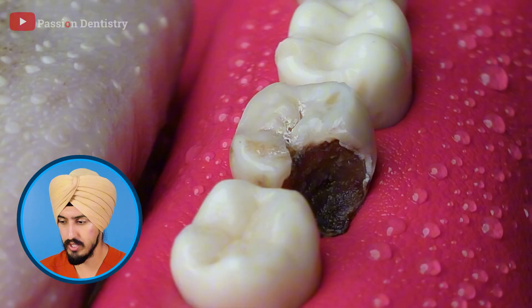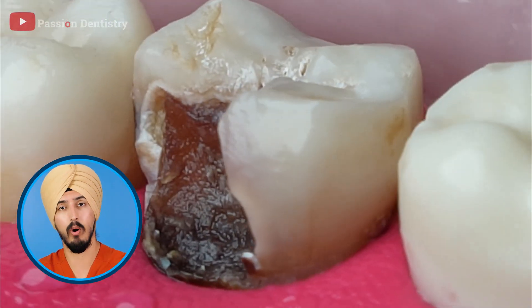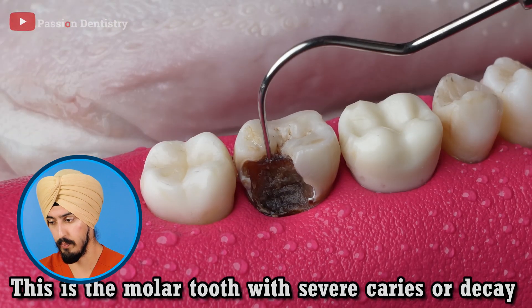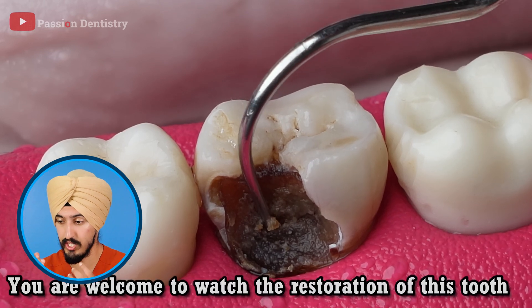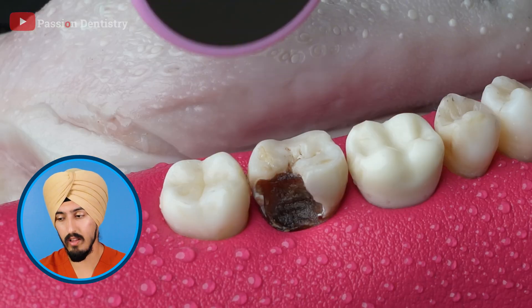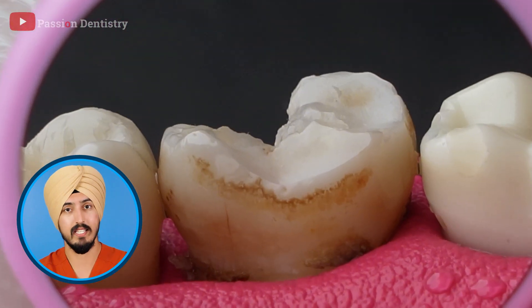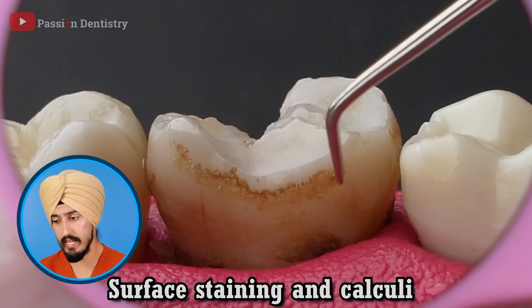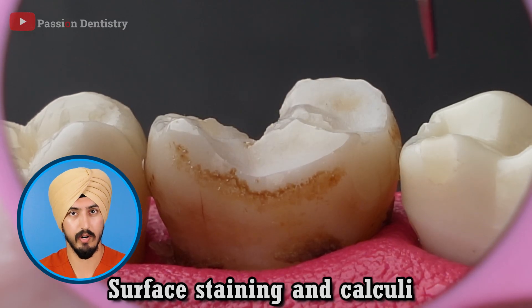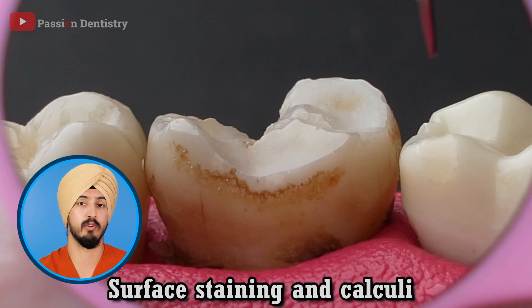So it's kind of just showing the tooth. That's a big cavity that basically looks like it's into the nerve and it's taking up a whole bunch of that tooth structure. He's checking it and that decay — the cavity part — is actually really soft. So when you take that explorer and feel all that stuff it's going to feel really soft. You have to clean away all the soft spots to see how much hard tooth structure is actually available. And that stuff on the other side is just staining and calculus, basically tartar. When you get this plaque buildup on your teeth, all that bacteria gets hardened and turns into tartar, which you need a professional cleaning to remove.